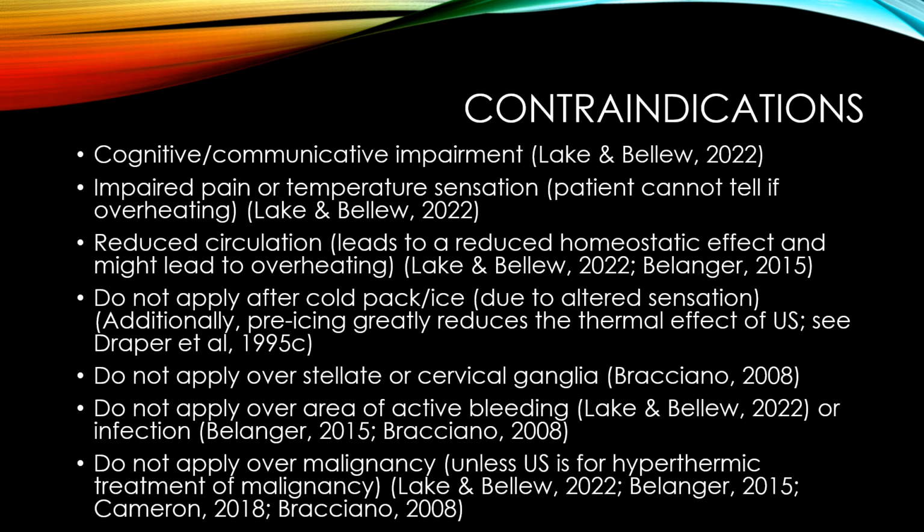You do not want to apply ultrasound after a cold pack or ice massage, again, due to that altered sensation. The impaired pain sensation, as you remember, is a contraindication in and of itself. Additionally, pre-icing would greatly reduce the thermal effect of ultrasound, so there's really no reason to do that.